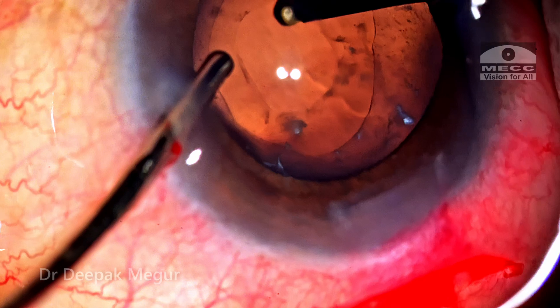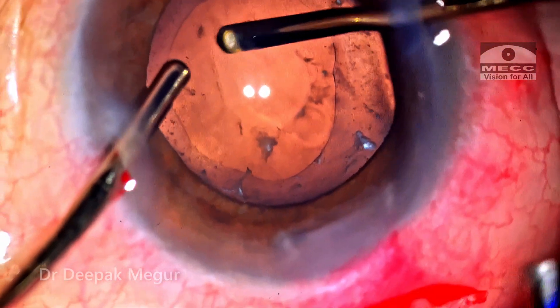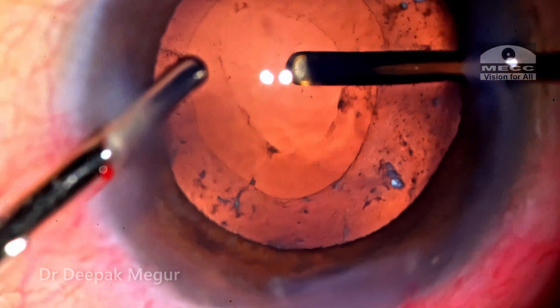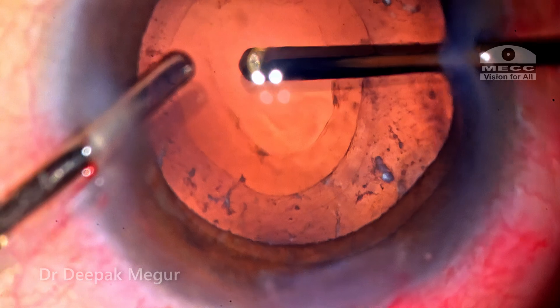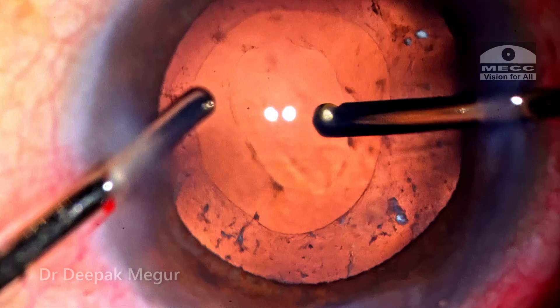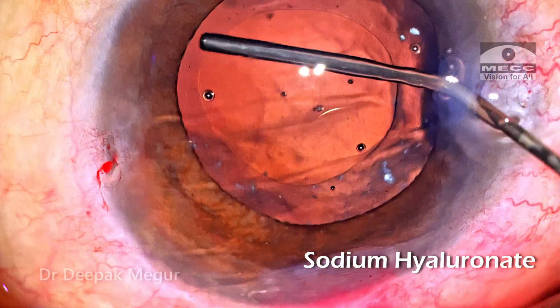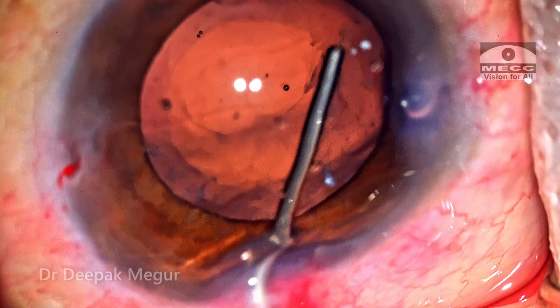The situation has been dramatically different from what I anticipated in the beginning. My original plan was to use a multi-piece lens. Now, since I have an opportunity to place the lens in the bag, I thought a single-piece lens would be much easier to implant in the bag, gentler, and would carry a lesser chance of the posterior capsule rhexis opening up. That's why I aborted the idea of a multi-piece lens and obtained an appropriately powered single-piece hydrophobic lens. The bag is filled with cohesive OVD to provide enough space.